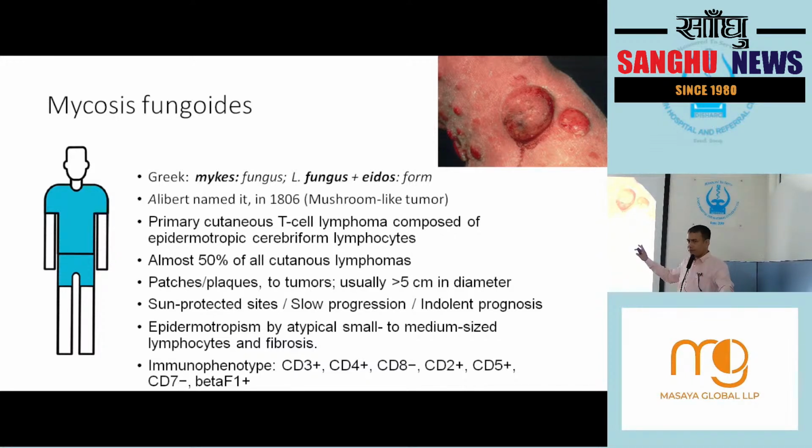I'm not going to go into this. This is more theoretical part. I'm directly going to case 2. And only one piece of information I want to give. This MF occurs in the sun-protected area. Remember, sun-protected, not sun-exposed area. Sun-protected area. This one.